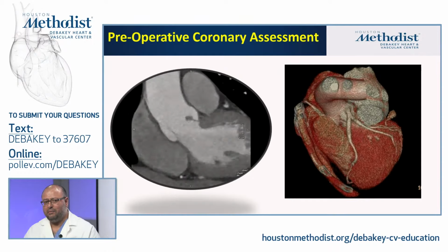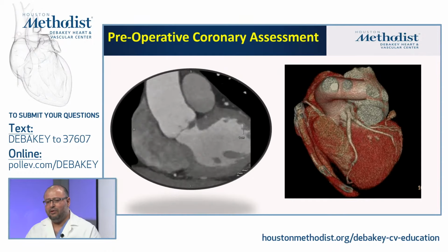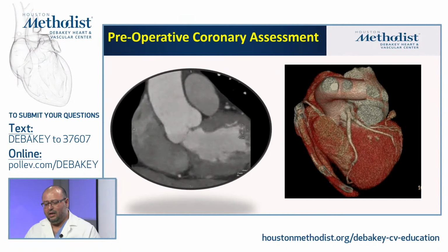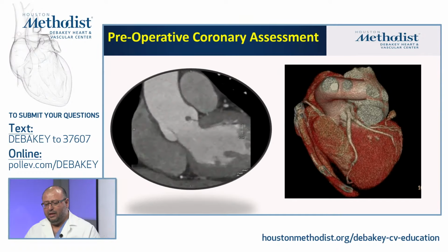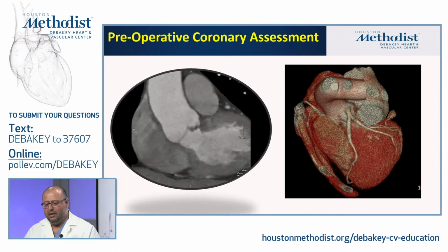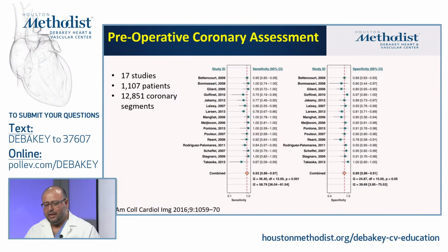Most often these patients, especially if they have aortic insufficiency, are febrile and tachycardic, and we are acquiring them despite having very high heart rate. And CT is still good, at least primarily to assess the main coronaries, but it depends again on the system.